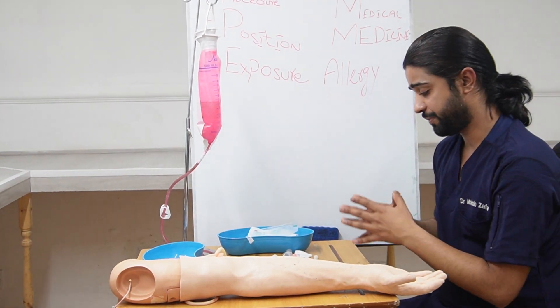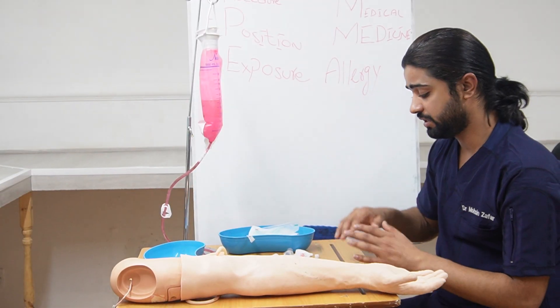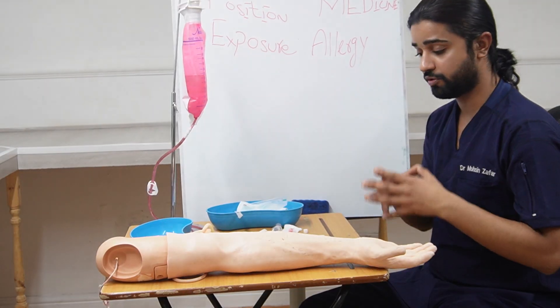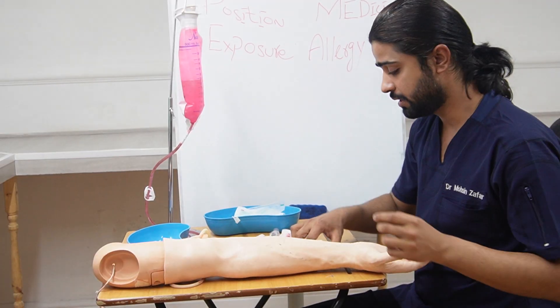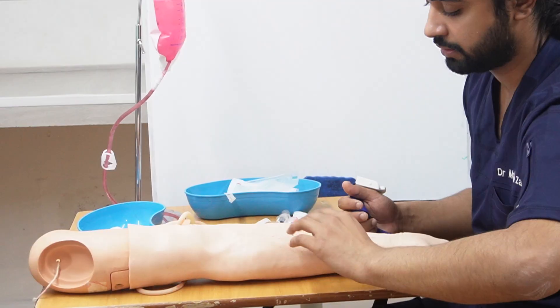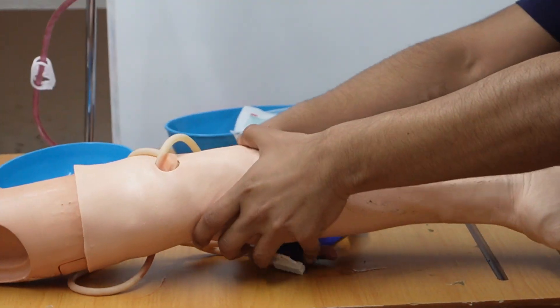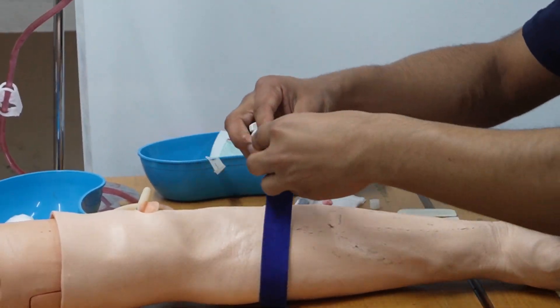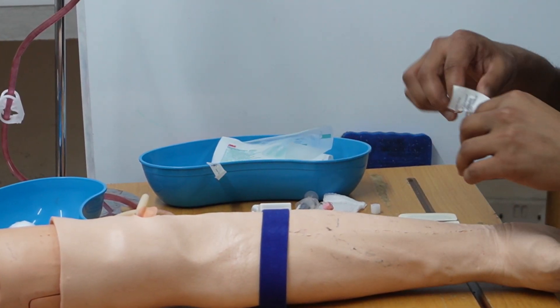So after this preparation we have done three things: we have opened the outer backing, prepared the IV cannula, and opened the Tegaderm and placed the small tape aside. Now we are going to start. Before touching the patient, assume we have put on gloves. After wearing gloves, we will feel for the vein where we are going to insert the cannula. Then tie the tourniquet and clean the area.